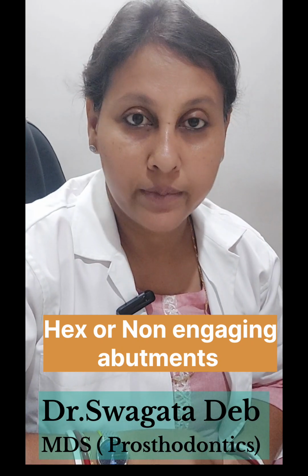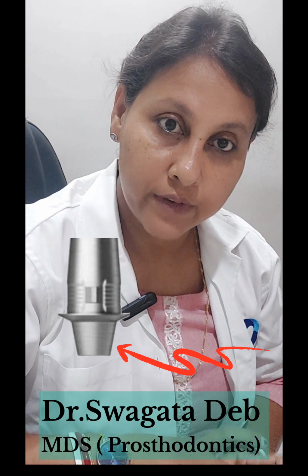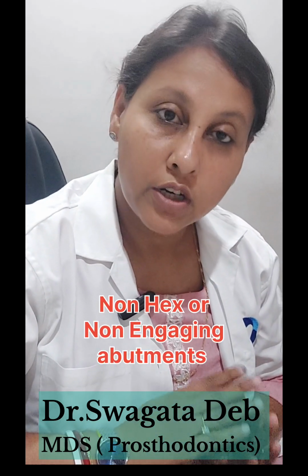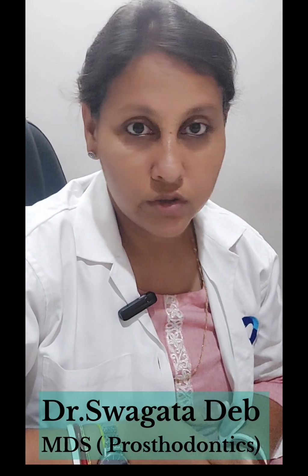In non-hex abutments, we don't have such flat surfaces that engage the implants. Those are called non-hex abutments, also known as non-engaging abutments. Usually the regular abutments which are available are hex or engaging abutments.